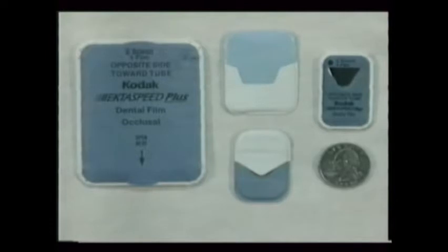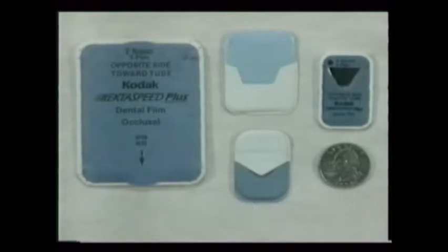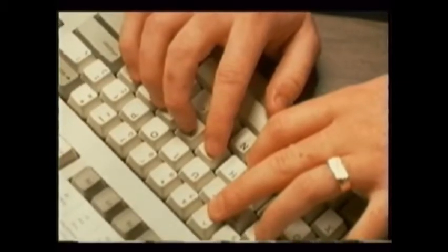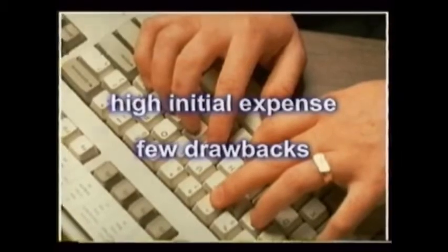Intraoral X-ray film comes in 2 speeds. With the ultrafast E-speed film now as economical and crisp as D-speed, while exposing patients to half as much radiation, there's no real reason to continue using the older D-speed films anymore. Some dental practices are using computerized X-ray imaging, in which no film or processing is needed. The X-ray image appears on a computer screen. Aside from the high initial expense, there are very few drawbacks to its use.